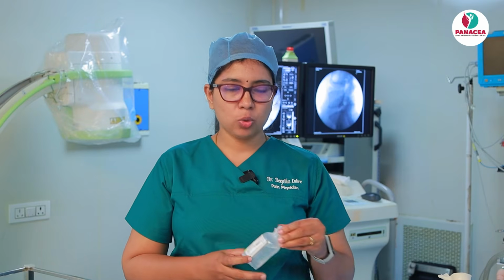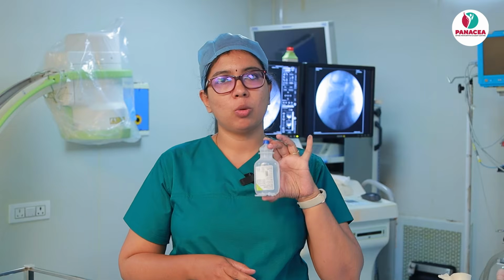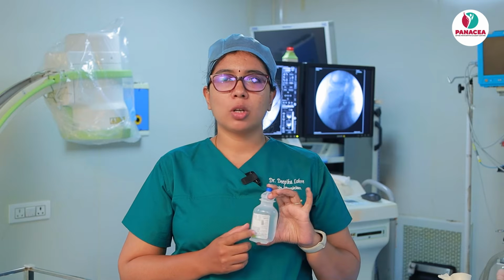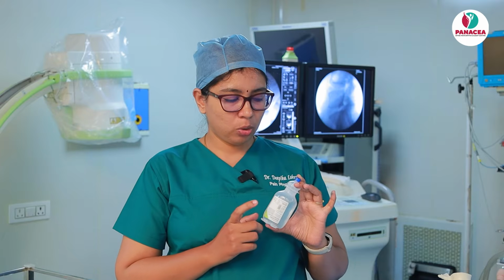Next, we are going to use this saline. This is just 100 ml saline which we are going to use. Again, only for one patient, one saline we will use, and we will discard this. We will not use it again and again, so that we don't cause any infection or any complication to the patient. So this we will take in a 10 ml syringe, we will take 10 ml, and this is to wash out any chemical mediators.